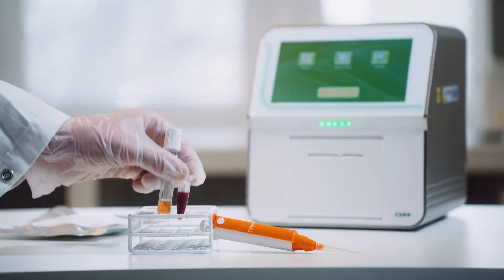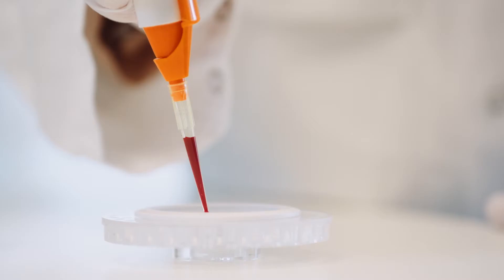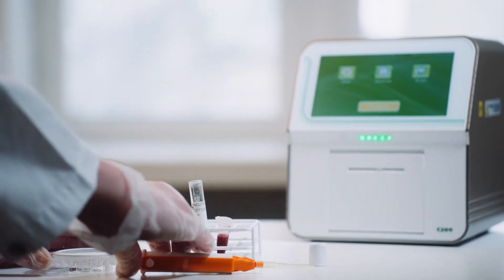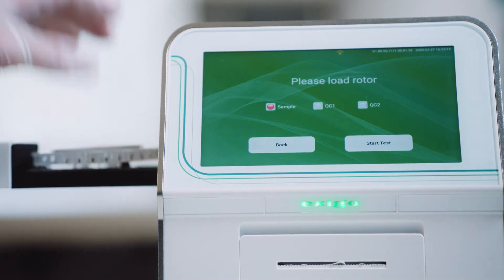Whole blood, plasma, and serum can all be used depending on your available material. The disposable reagent discs containing freeze-dried reagents make the instrument extremely easy to handle. No preparations required, no pre-dilution required, no startup times required, no individual loading of different parameters.